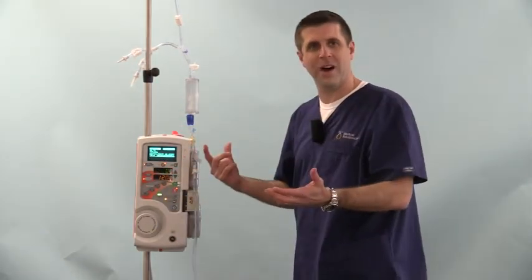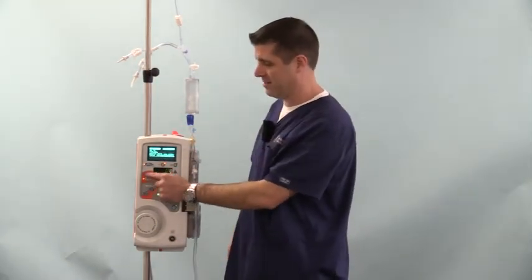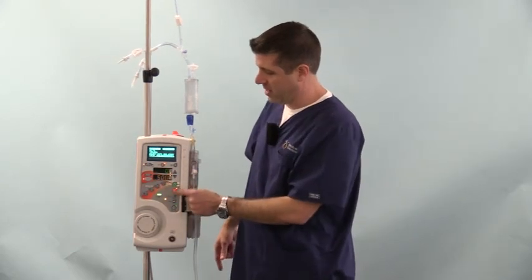And now I'm ready to run. I'll start with rapid. Default is 500 mLs per minute. I'll hit start, and I'm flowing at 500 mLs per minute.